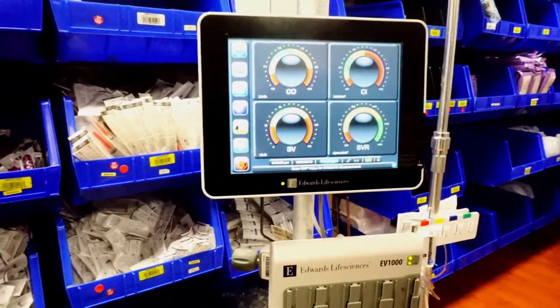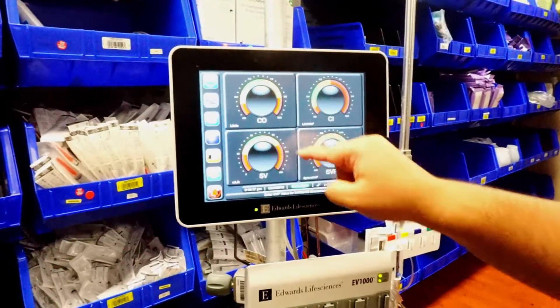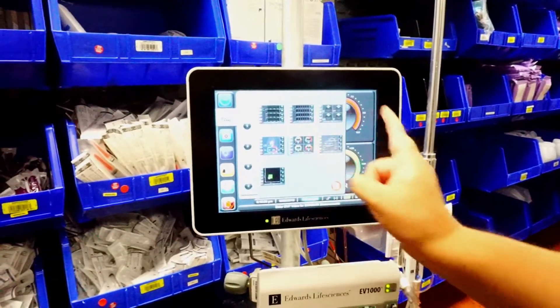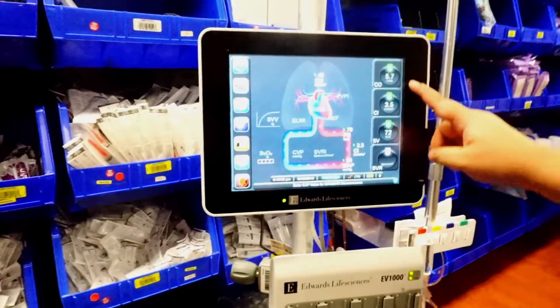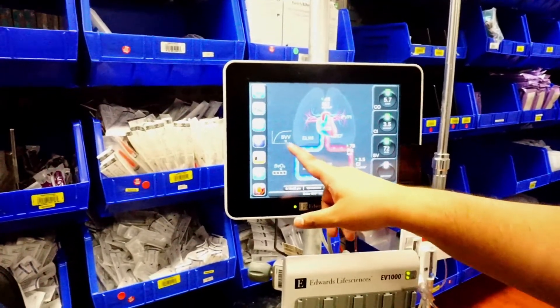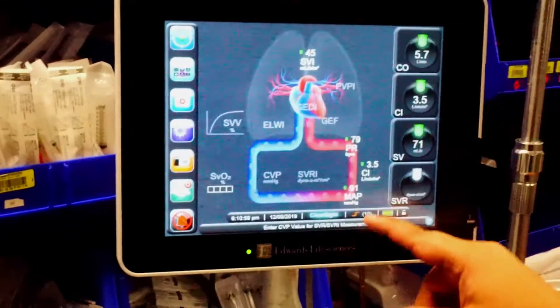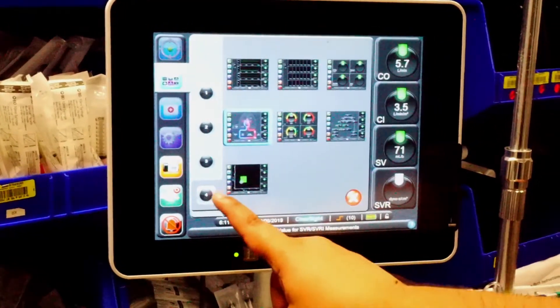Press home and then press the start button. After a few minutes you'll get your numbers. To change the screen display, come to the screens menu and choose from any of the options. One popular screen shows all your numbers: cardiac output, cardiac index, stroke volume, a cardiovascular system overview, and the Frank Starling curve. You also get extra values like heart rate, MAP, and stroke volume index. You can choose to display 1, 2, 3, or 4 values.